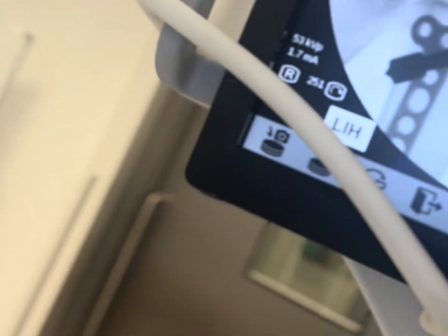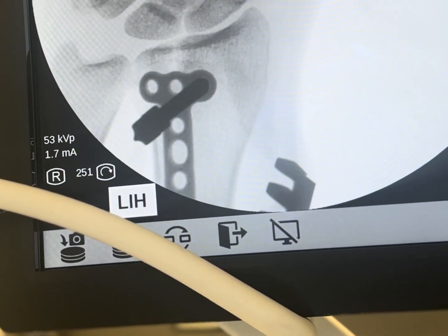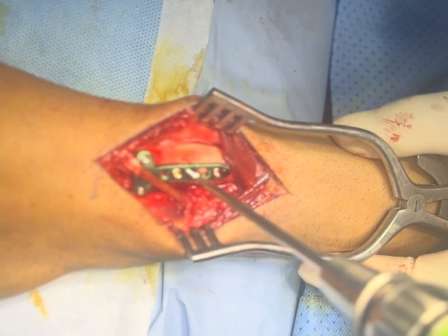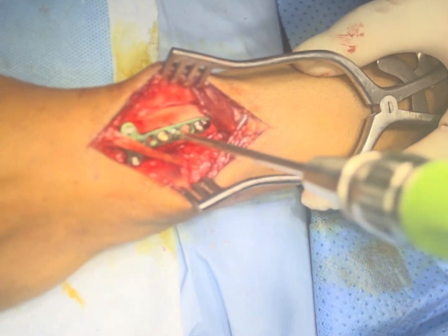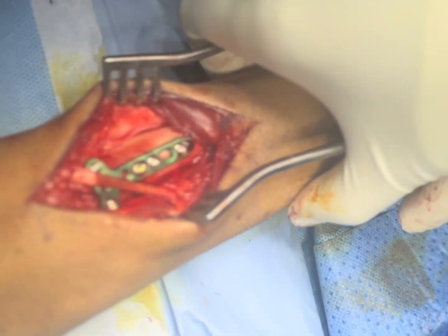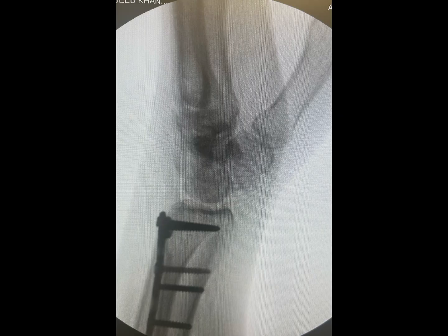I have placed the plate now and we will check on the C-arm. We need to move it a little bit distal to localize the plate position, then secure it. We have put two locking screws in the distal fragment and two in the proximal fragment. The final fluoroscopy image — AP and lateral — shows the fracture is well aligned.